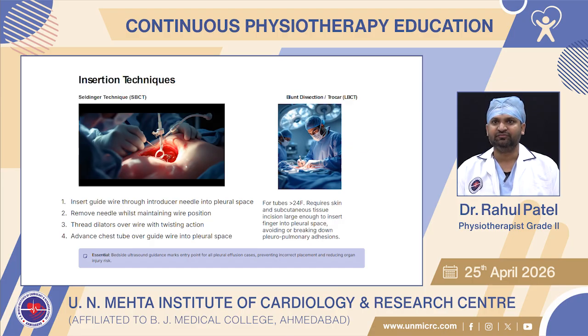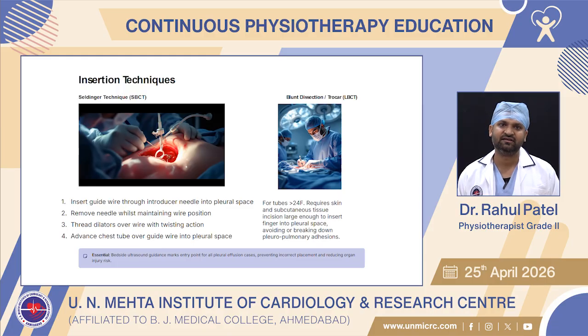Large bore chest tube: a tube greater than 24 French requires skin and subcutaneous tissue incision large enough to insert a finger into pleural space, avoiding or breaking down pleuropulmonary adhesion. Essentially, bedside ultrasound guidance marks entry point for all pleural effusion cases, preventing incorrect placement and reducing organ injury risk.